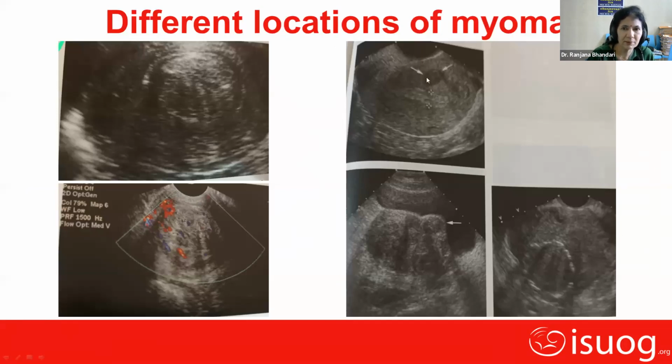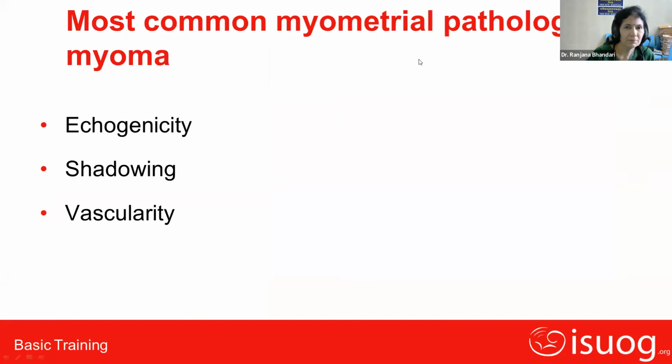This is endometrium and this is serosa. This one is the urinary bladder. See, multiple myomas are there, but this one is a subserosal myoma. See, it is projected towards the urinary bladder. So this is subserosal myoma. This one is a calcified myoma, although it is intramural, totally covered by calcification, or Wormstell eggshell appearance of calcifications.